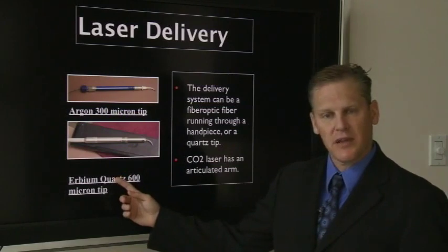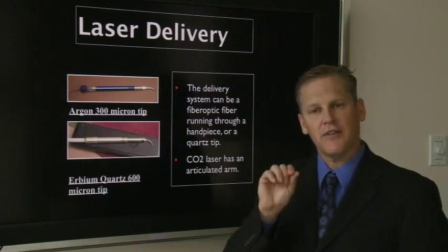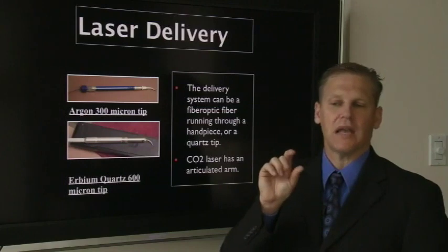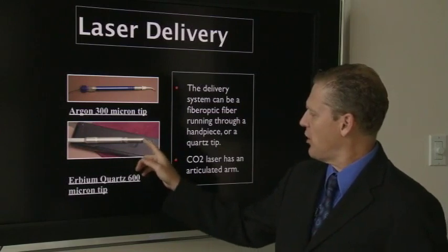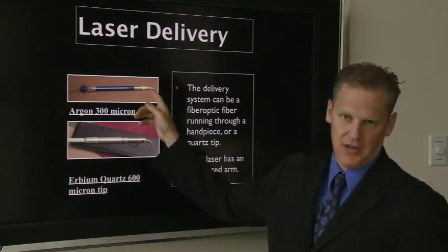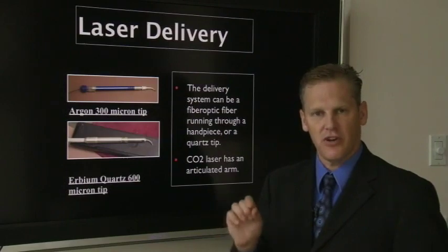Some of the erbium lasers, hard tissue lasers, have tips that are autoclavable. They are different sizes, different diameters, different lengths, and also different curves in some of them. So this is an erbium laser, and there is an autoclavable tip. This particular system with the optical fiber, for diodes, you have to cleave, remove after each patient the portion that you've cleaved, and start fresh and initiate the new tip.